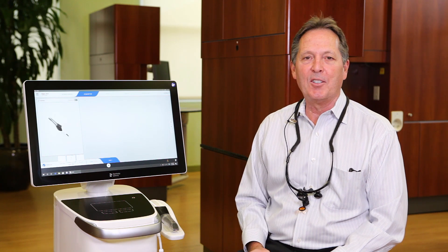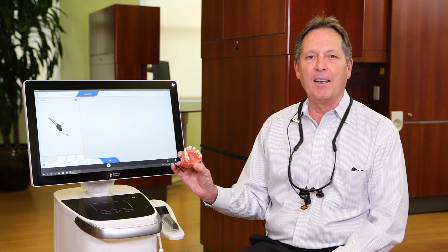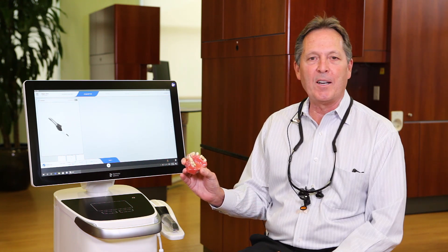Here's a quick video on the upgraded scanning capabilities of the PrimeScan. What I have is a typodont that has been around in my office for about 30 years. It has a few gold restorations on it.